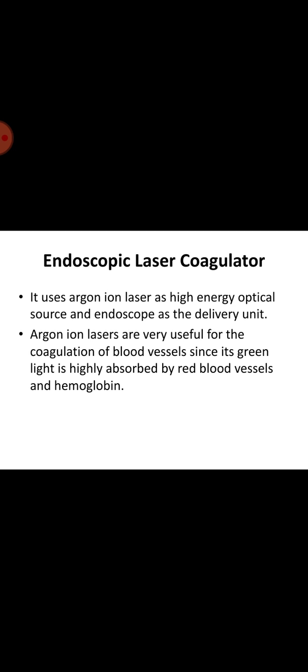With approximately 14 watts of laser radiation available, about 10 watts can be deposited distally, and pilot studies with experimental animals have shown that the system can be easily adopted and operated with a conventional endoscopy procedure. Rapid hemostasis was observed in experimental animal studies using this technique. Although the endoscopic photocoagulator system has been found to be functionally reliable in animal experiments, it has some limitations. The major problem is that it is difficult to control severe bleeding of more than 2 cc per minute, as the technique can photocoagulate only low to moderate bleeding ulcers quite well.